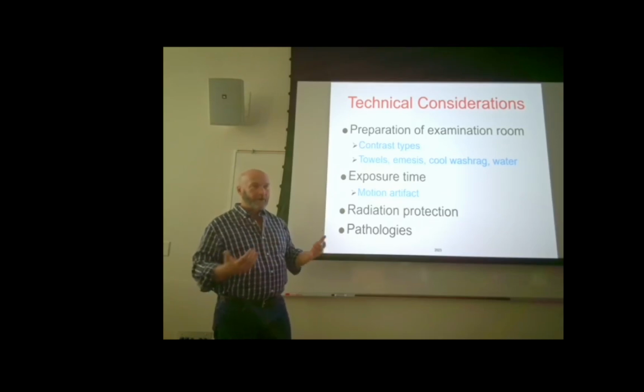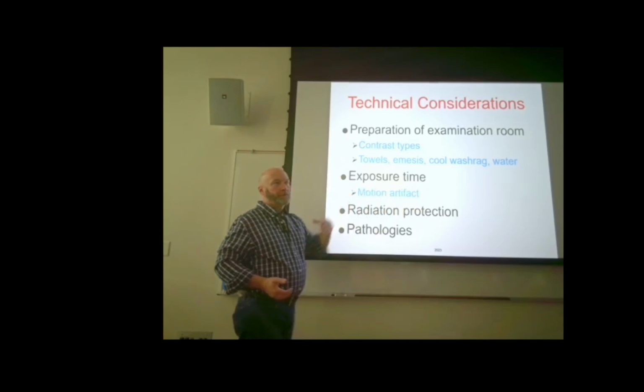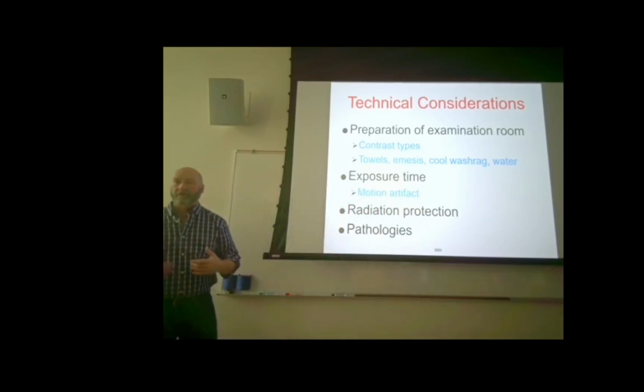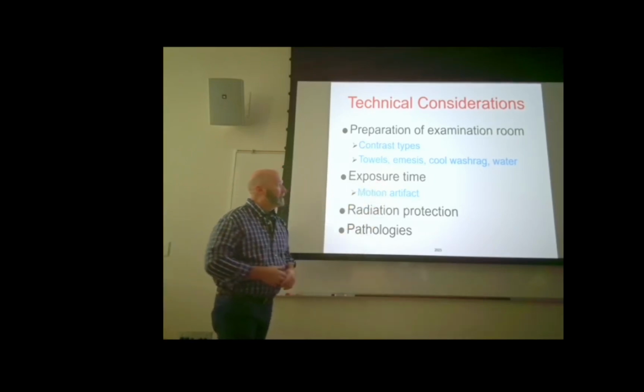So make sure you have all of that, and we want to make sure we have some water on board too. If we're doing an upper GI or esophagram, what we might be doing that for is reflux. And I'll talk about how the water plays into that here in a minute.